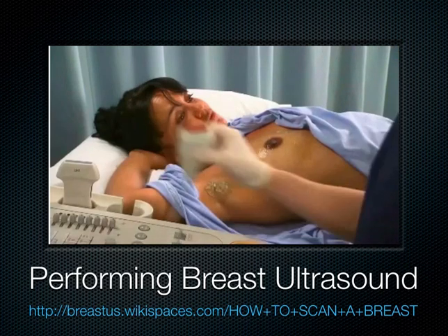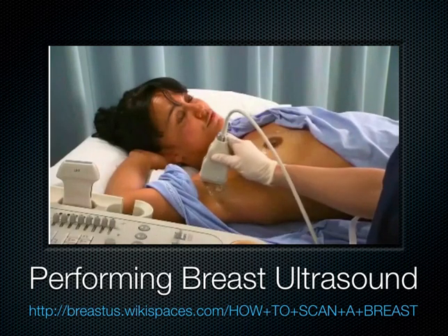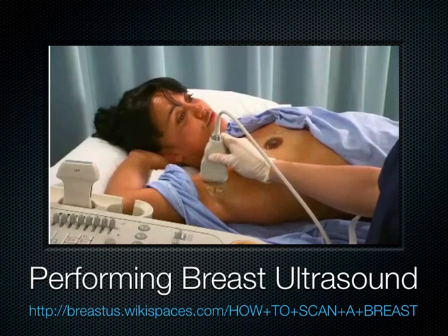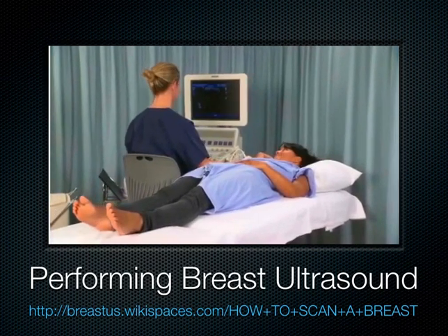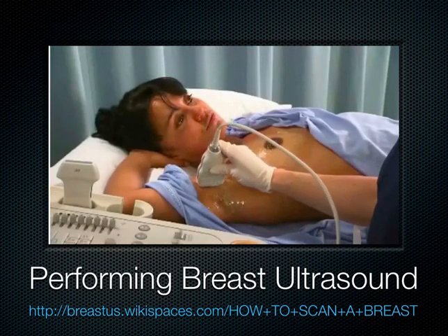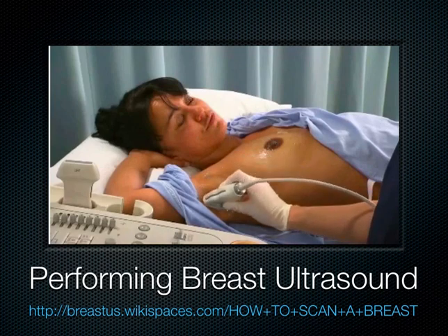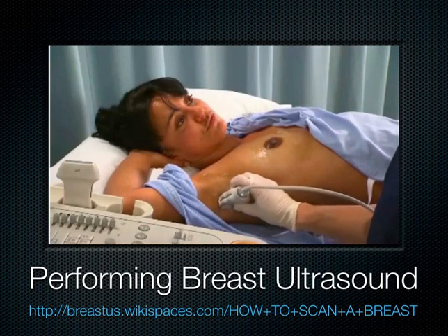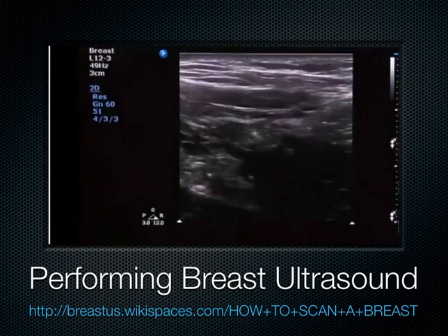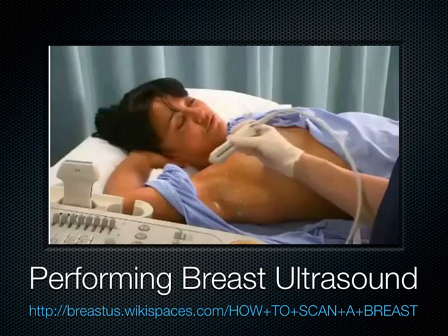To scan the axilla, place the transducer in the longitudinal plane of the superomedial aspect of the axilla with the notch pointing superiorly. Using a grid technique, slide the transducer horizontally towards the superolateral aspect. Then slide it inferiorly to the inferolateral and finally to the inferomedial aspects of the axilla.